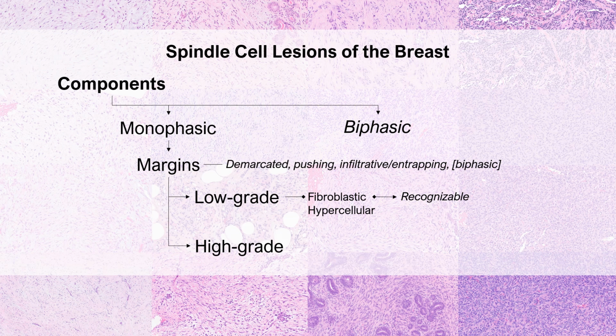High-grade neoplasms, though, include a broader range of diagnostic entities. And while there may be histologic clues that aid the diagnosis, such as a transition to epithelioid cytology in the case of metaplastic carcinoma, these lesions are seldom able to be diagnosed by H&E alone. And though undoubtedly of importance for low-grade lesions, the clinical context is paramount to accurate diagnosis of high-grade lesions.